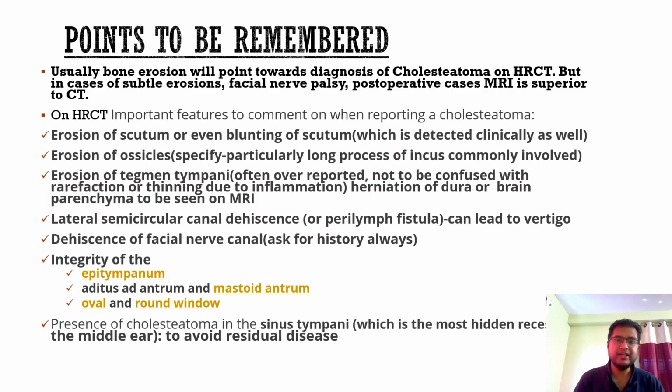So what are the important points to be remembered while reporting a CSOM case? Usually a bone erosion will point towards the diagnosis of cholesteatoma on HRCT itself. So why is MRI of the temporal bone required? In cases of subtle suspected erosions, facial nerve palsy, and post-operative cases particularly, to differentiate residual cholesteatoma from granulation tissue and scar tissue, which will all appear as soft tissue density within the middle ear, MRI is superior to CT and definitely will help in the diagnosis.